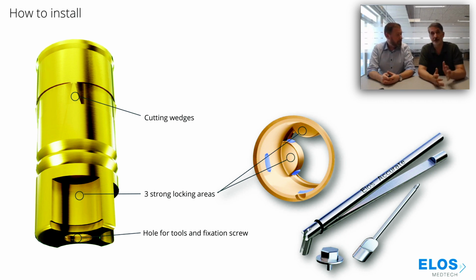Right. And it's color coded. Yeah. Which is maybe important if you have a box full of PMAs. You see, this is referring to this platform or to the other platform. So it's following the anodization of the original providers, right?